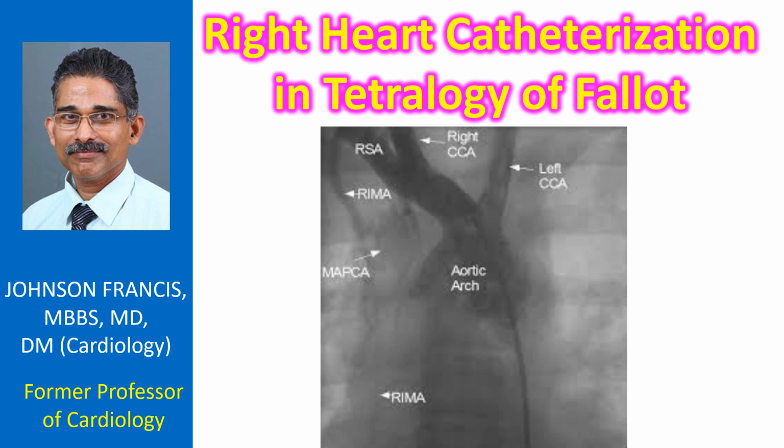With the availability of high resolution echocardiographic images and Doppler echocardiography, the role of cardiac catheterization has come down in Tetralogy of Fallot and other congenital heart diseases in general. Important risks for cardiac catheterization in a deeply cyanotic infant are the chance of precipitation of a cyanotic spell and thrombotic strokes due to hemoconcentration.